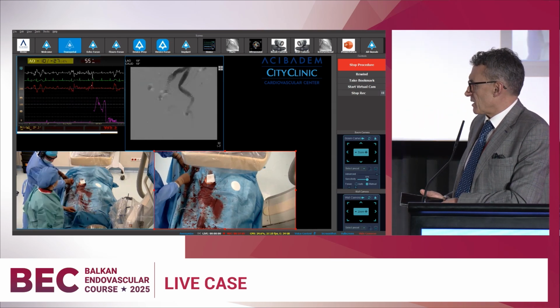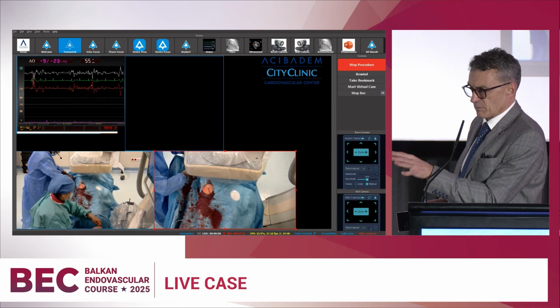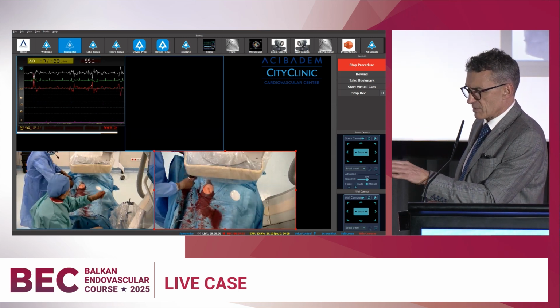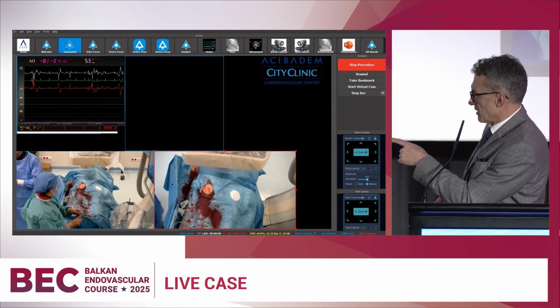Okay. In fact, I can try to say several words about the endoleaks closure. Valeri, what do you think?